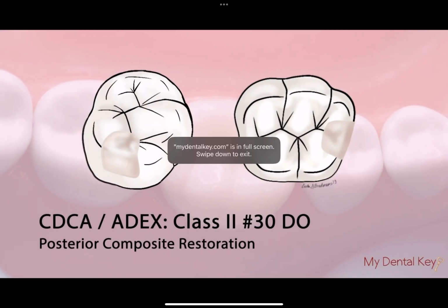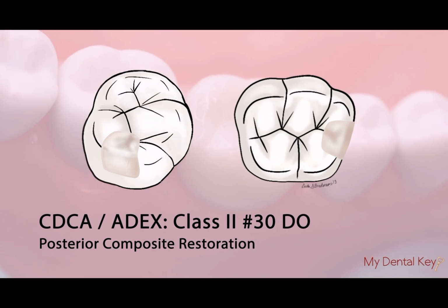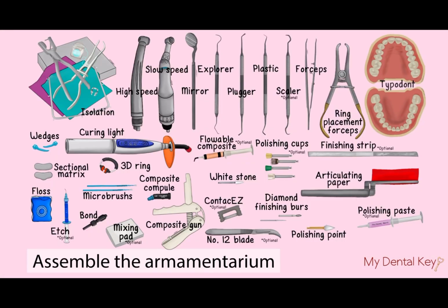Tooth number 30 DO for the ADEX or CDCA exam. The steps outlined in this video are specific for the mannequin version of the exam. First, assemble the armamentarium as shown in this illustration. Note that the materials included in this illustration include specific modifications for a typodont exam.